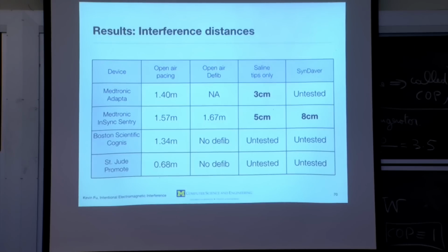However, for an externally worn device, we don't know. We haven't done any tests on insulin pumps yet. There are plenty of different devices, glucose sensors, for instance, that are percutaneous. I wouldn't be surprised if someone here has one. They're pretty common, but we just don't know yet.